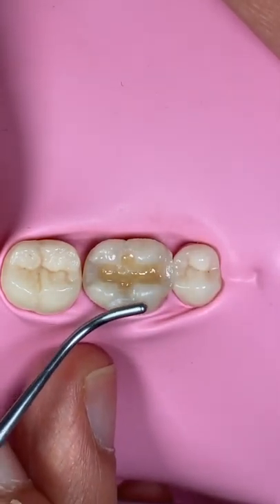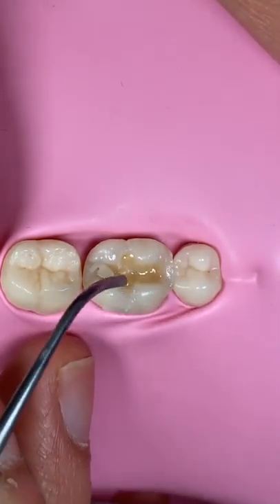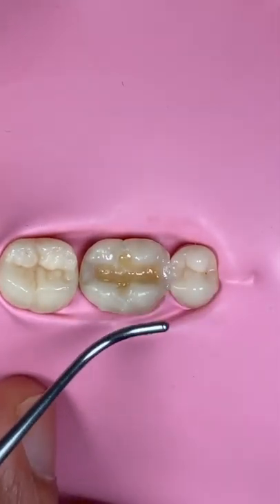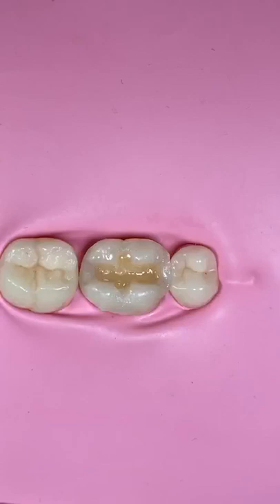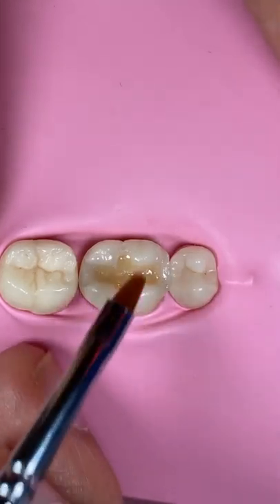Okay, for buccal, sometimes I do only one layer here, like this. Yeah, just take a big amount, and then do like this, reduce. And then take the fill brush. So do the buccal pit just like doing the anterior. Yeah, sometimes don't forget about the labial.